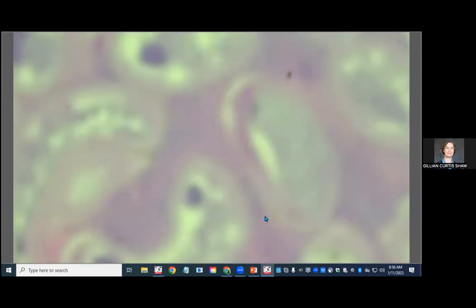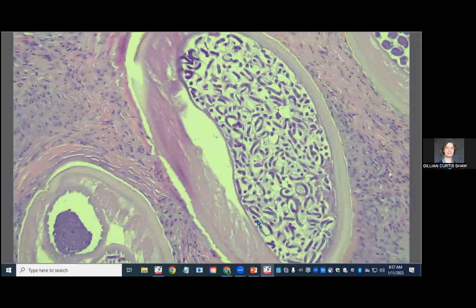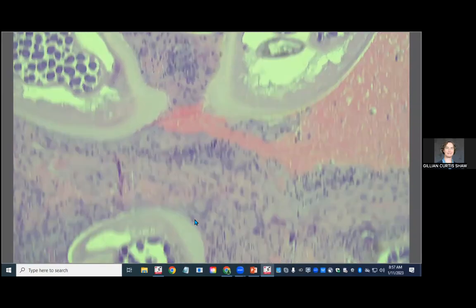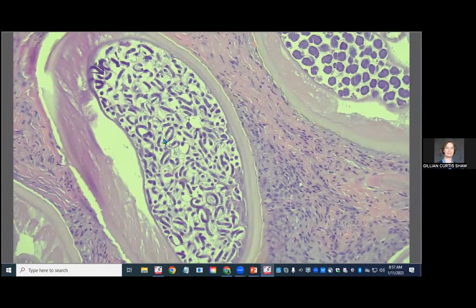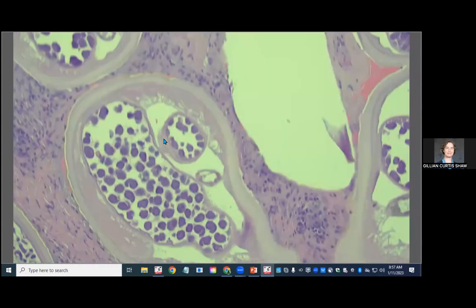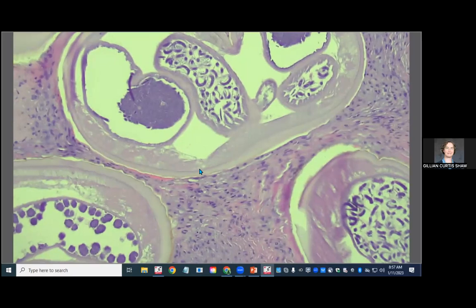They have a cuticle, and they have some internal organs. The cuticle, especially in the cross section of the worms, they're worms, has cuticular ridges, which are annular, which is important for the identification of this creature. They are adults, and we know that because they have reproductive structures in them with tiny baby worms and other things, which I don't know what those are. Somebody else can probably chime in. I should know all of these words for what we're looking at here, but this is some of the musculature inside of this worm. And then we also have a pseudocoelom, which tells us that it is a nematode parasite and not a trematode or a tapeworm of some sort, because those types of worms do not have pseudocoeloms.